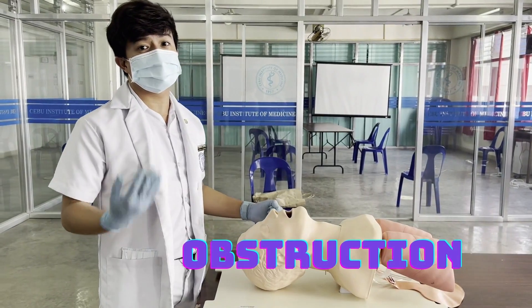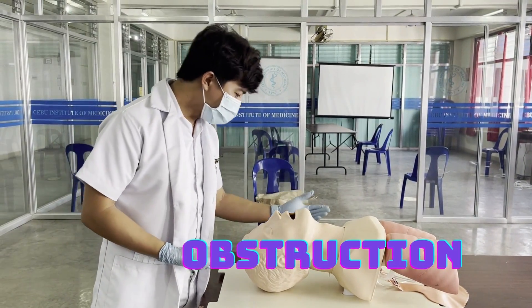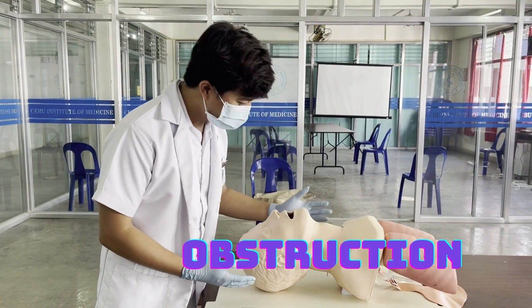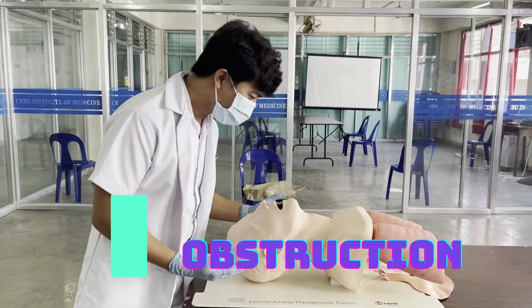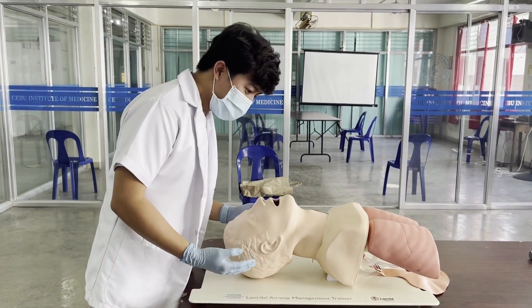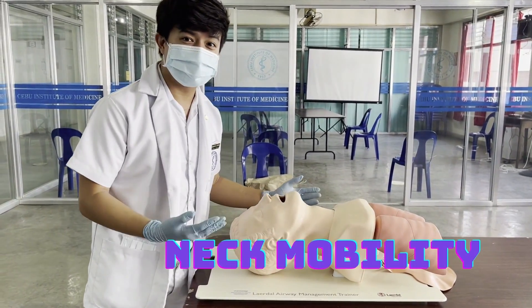Next, we assess for any signs of obstruction, such as tumors, abscess, foreign bodies, and expanding hematoma. Neck mobility is also checked.